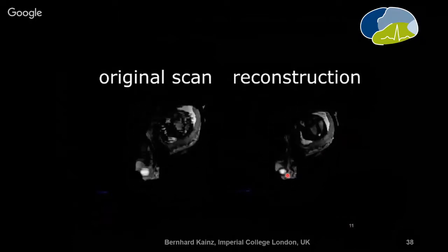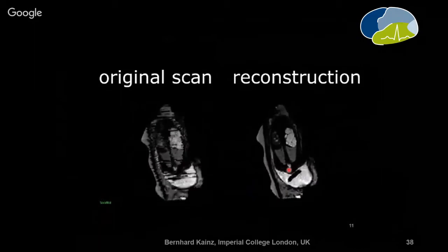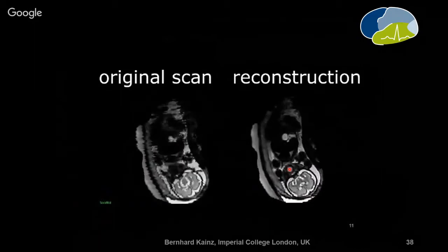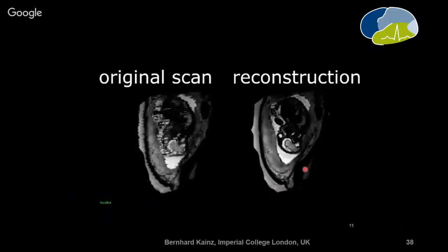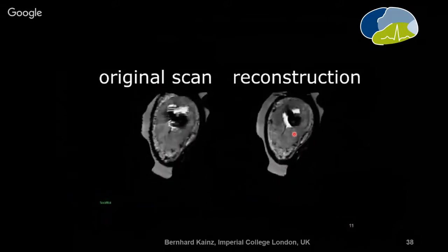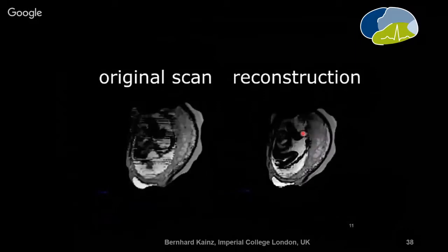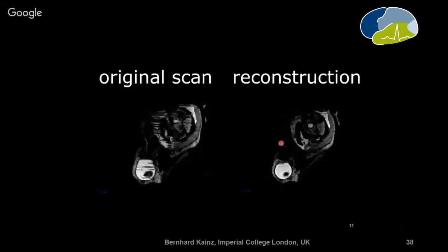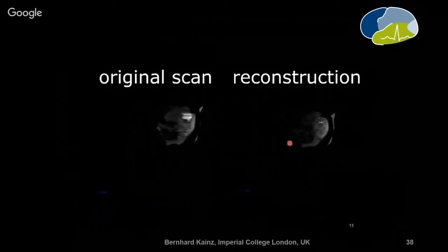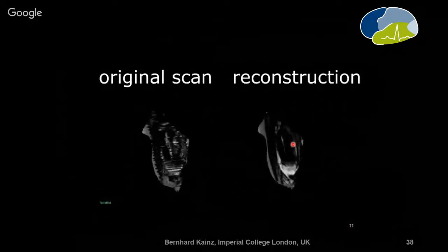So this is something which was completely new, because it was very hard to this point to reconstruct structures like the kidney. If you remember the heart from before, the centimeter structure, a kidney at this age, so these two are around 28 weeks, is not even half a centimeter on the long side. The short side is maybe a few millimeters. And this is a cystic kidney, which was very hard to investigate before these kinds of techniques.